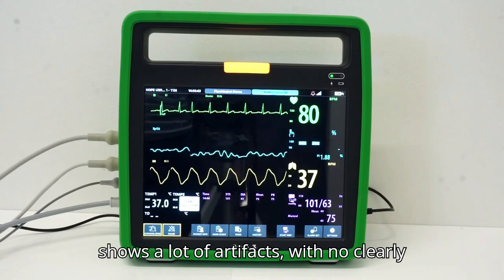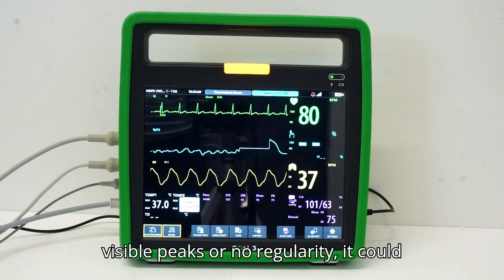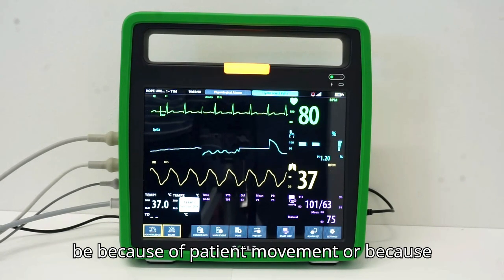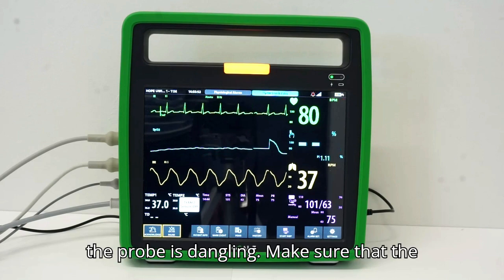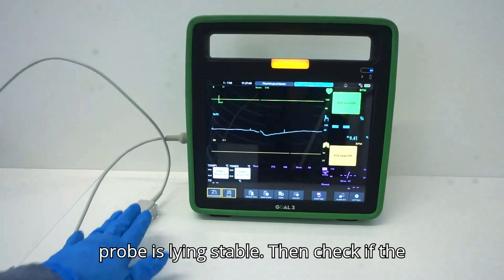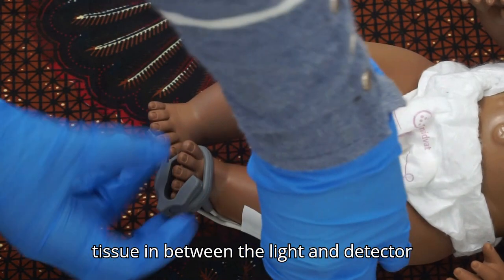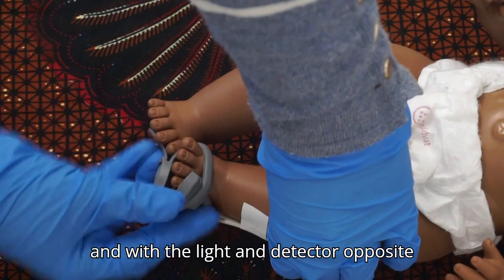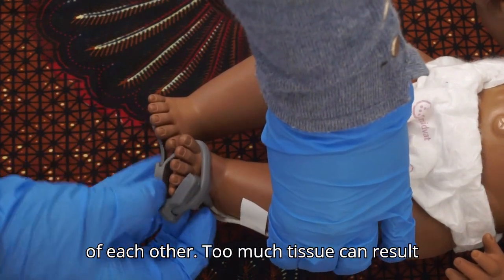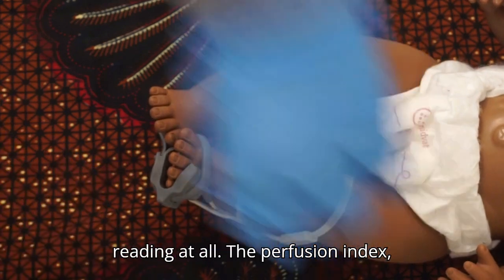If the signal shows a lot of artifacts, with no clearly visible peaks or no regularity, it could be because of patient movement or because the probe is dangling. Make sure that the probe is lying stable. Then check if the probe is positioned properly, with enough tissue in between the light and detector and with the light and detector opposite of each other. Too much tissue can result in the light not going through and no reading at all.